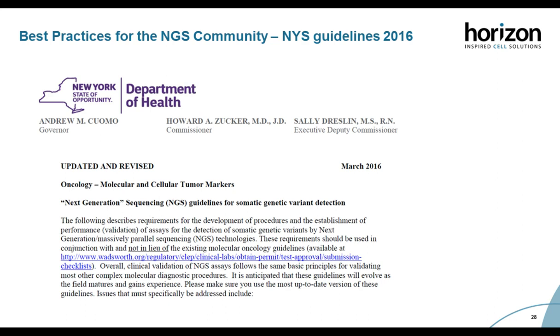Secondly, we see a lot of our users relying upon the New York State guidelines. And here we have a publication from them in 2016 called Next Generation Sequencing Guidelines for Somatic Genetic Variant Detection. And this remains one of the gold standard guidelines in place today for NGS labs.